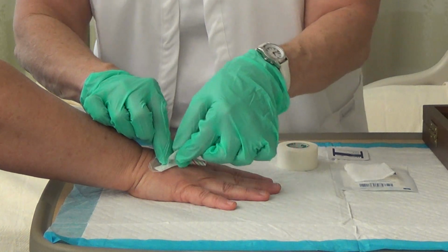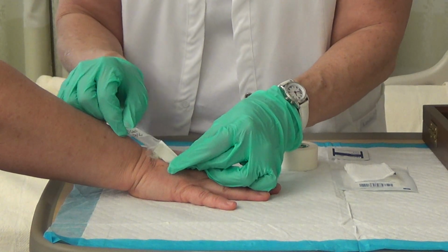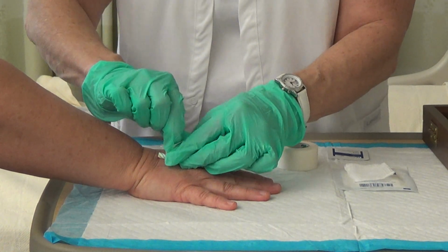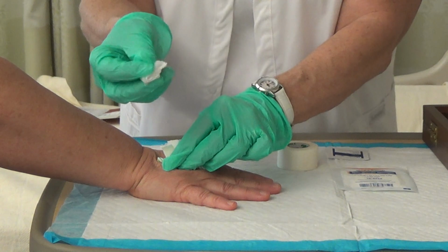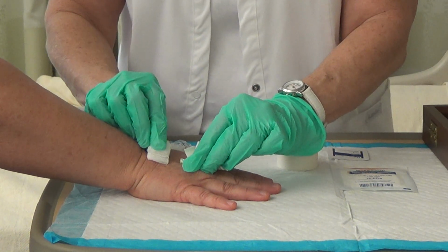Okay, so again, I'm pulling towards the insertion site. Towards the insertion site. I'm going to lift up the wings of the chevron. This is where it's inserted. So I'm going to take my 2x2 and fold it over. And as I pull the needle out, I'm going to apply pressure.